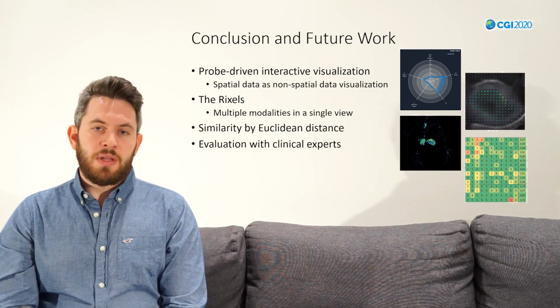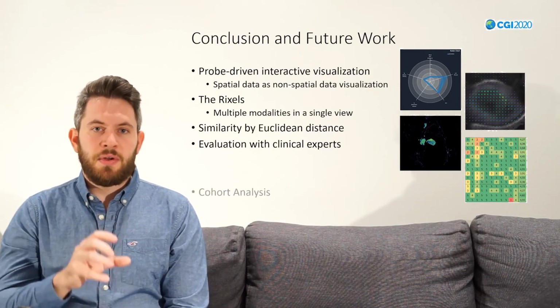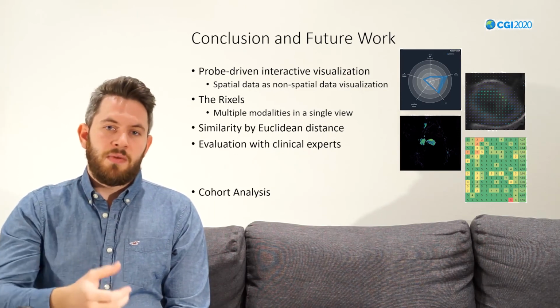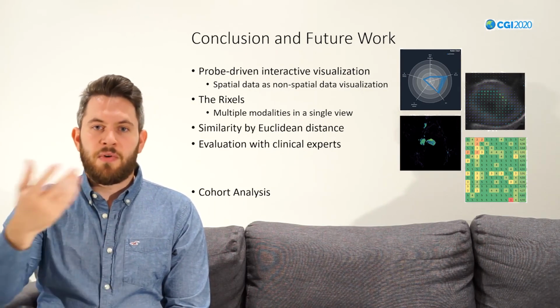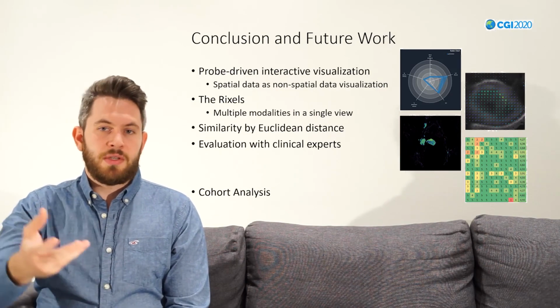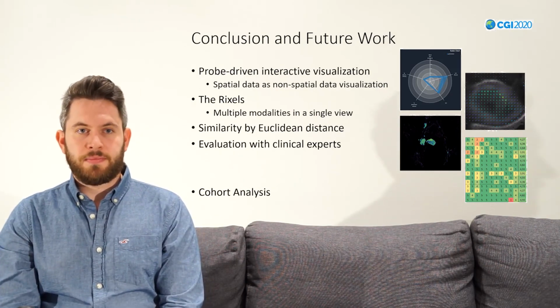And for the future, we would like to take the characteristics that the radiologists find using our system to a cohort level and see if this characteristics holds up for a higher number of patients. And this could also be used then, for example, for segmentation purposes.